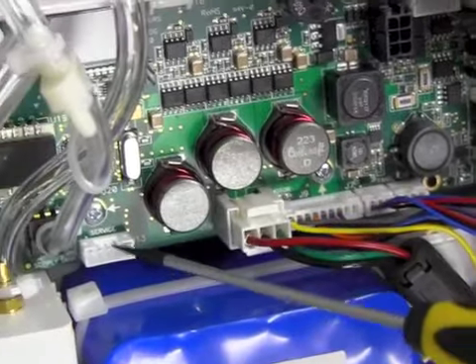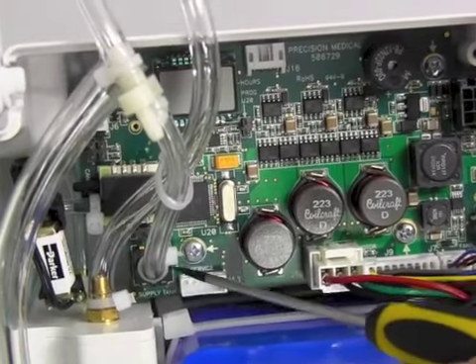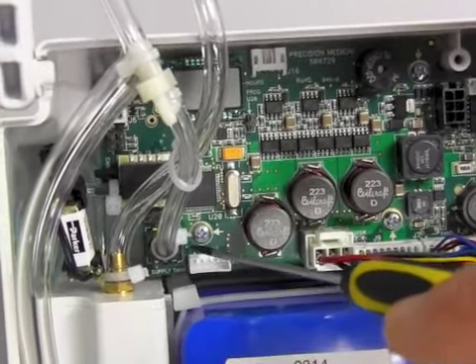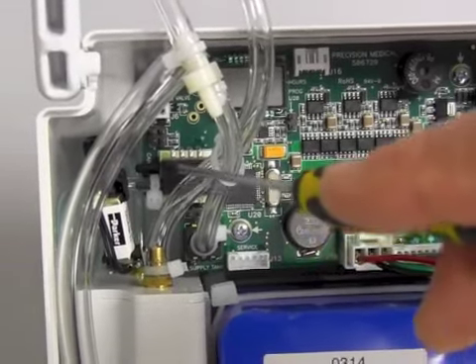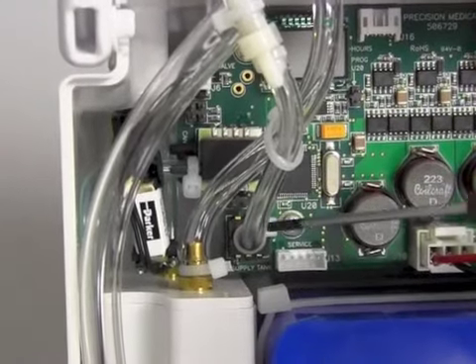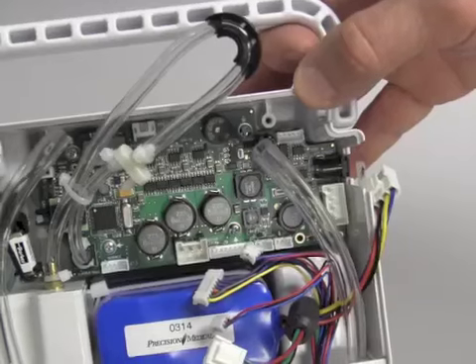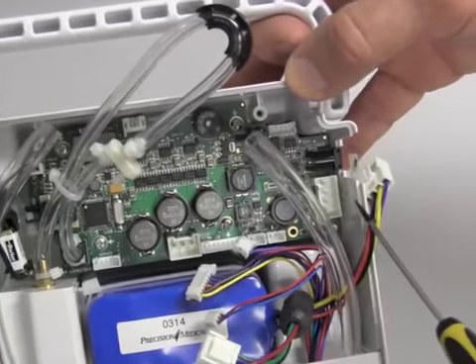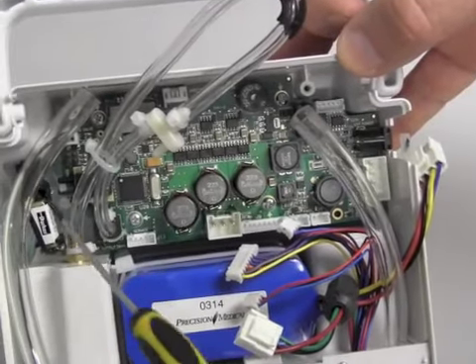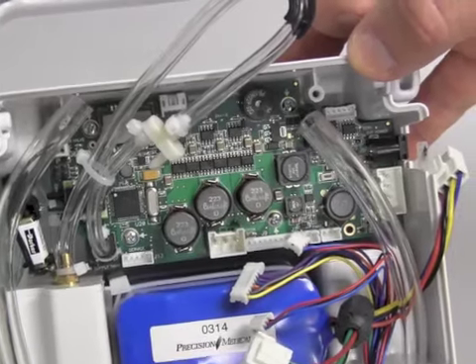Also, there are 2 tubes, Tygon tubes, that have to be removed from the circuit board. One I'm pointing at here is the pressure sensor, and that wire tie will have to be cut. And the other one is on the sensor for the POC, and this also has to be cut, and both of those Tygon tubes have to be removed. Alright, I have removed the 5 plugs from the circuit board, and I have cut the 2 wire ties on the Tygon from the sensor and the pressure sensor.